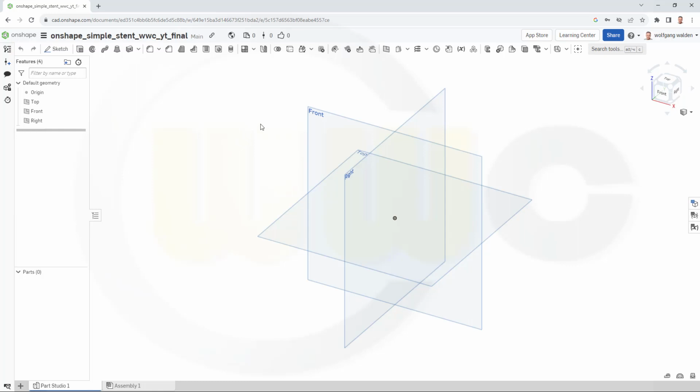First, I want to define some variables. So, go for the first one and call this one stent length. And this might be 200 millimeter. Second one would be the stent diameter. And this could be maybe 30 millimeter. And the last one would be the wire diameter. And there I want to go for 1 millimeter. And confirm.